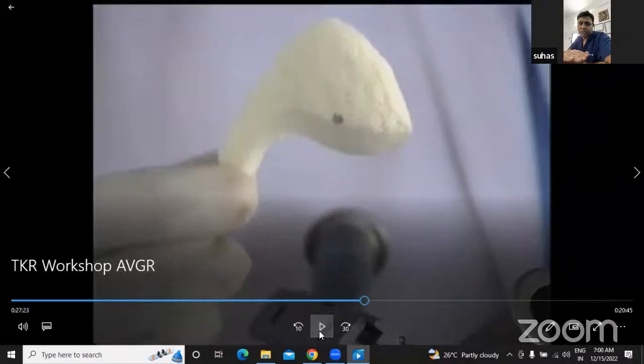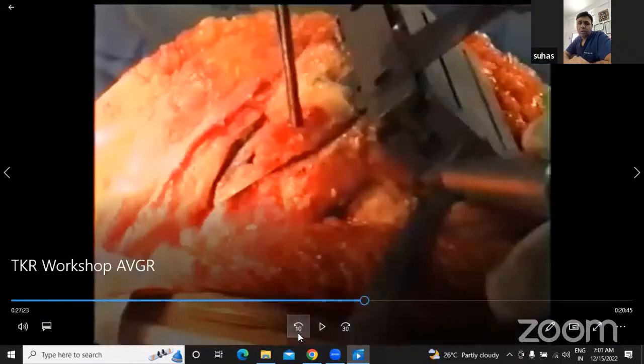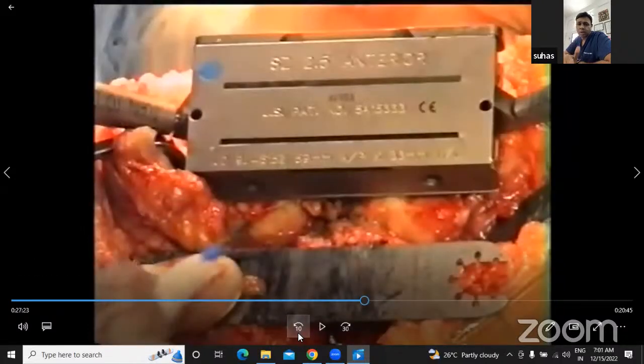Here again, another tip is which side should you cut first? Always try cutting medial, because if medial you are deep, then lateral definitely you will notch. So start medial and see if you've cleared yourself. If you're cleared, then you can swing your arm and try to cut on the lateral side. If you directly go lateral, then you might miss that one last chance of not notching. So always go medial, make sure you're not notching, and then swing your arm to the lateral side.